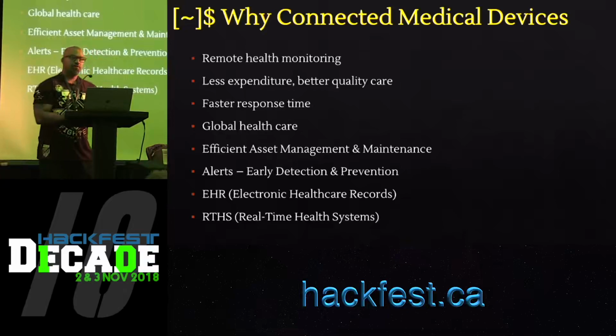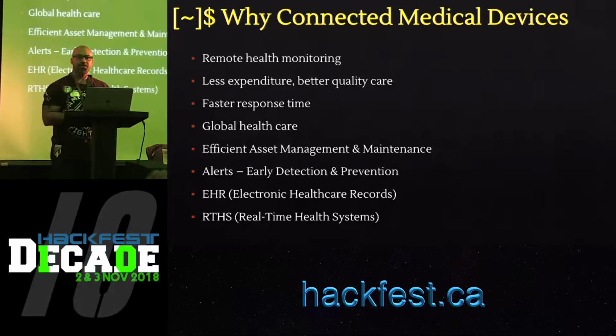Global healthcare is another big factor, and it's not happening that much right now, but think of the application of connected medical devices in underdeveloped countries where medical staff is always a scarcity. Since all these medical devices are connected to a central system, it becomes very easy to maintain them and upgrade them if need be. Alerts, so for example, the insulin pump is monitoring the patient's insulin level, so if it sees a deviation from normality, it can inform the patient, and then they can take preventive action based on that alert.